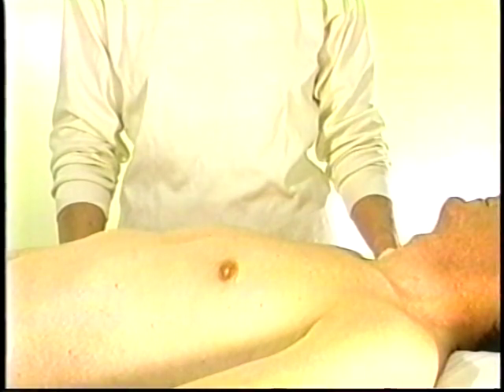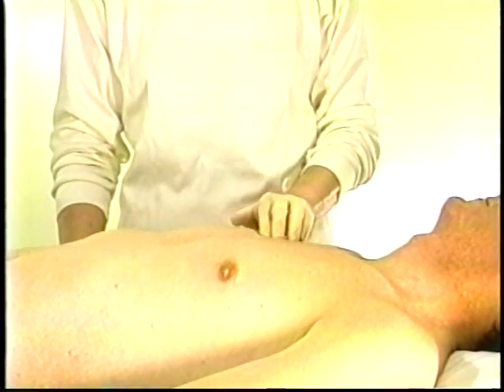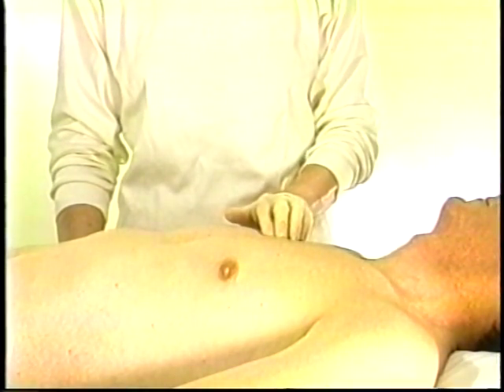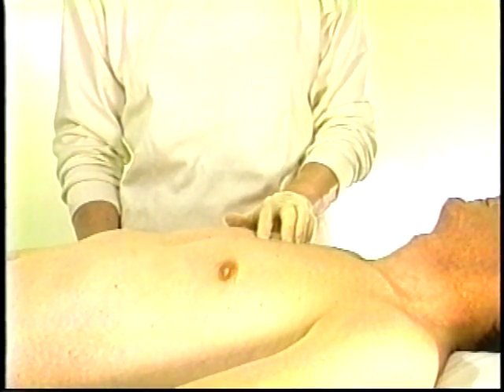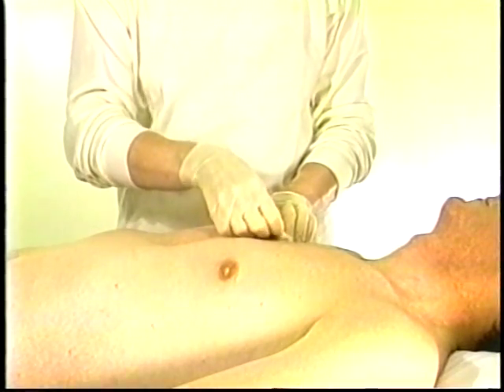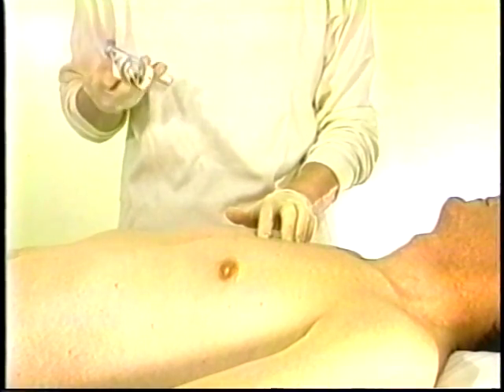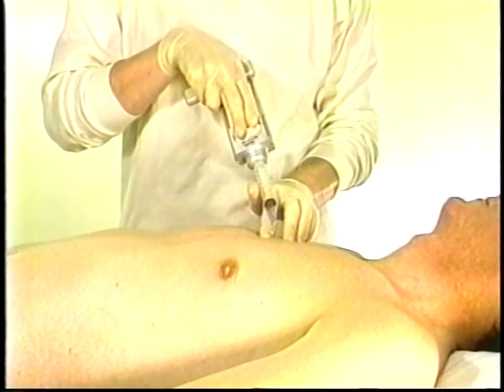Now let's move on and do a thin needle aspiration biopsy on an actual patient. I start with careful palpation and estimation of the size of the mass and the depth under the skin. I then place my fingers on top of the mass, spread them, and hold the mass firmly. The skin between my fingers is cleansed with a simple alcohol swab. Now, without moving my fingers, holding the target, I pick up the instrument and get in position.